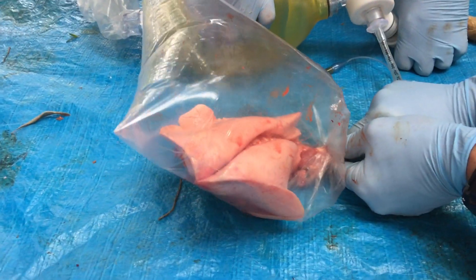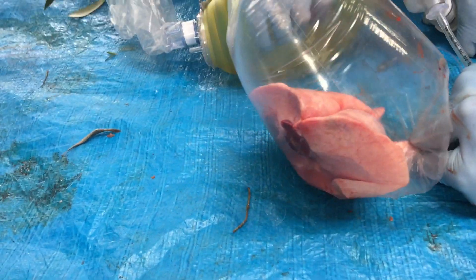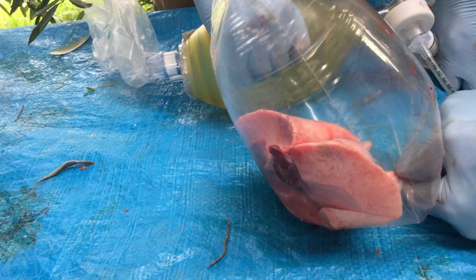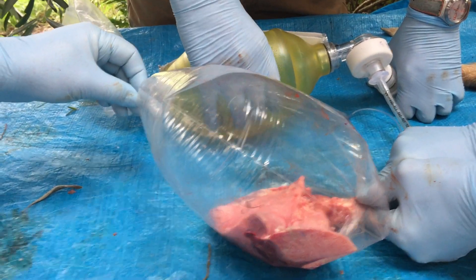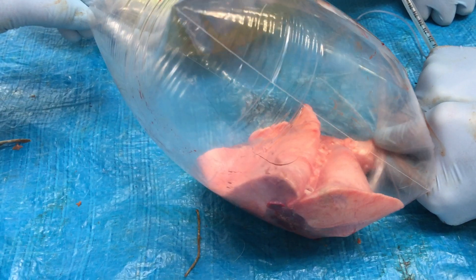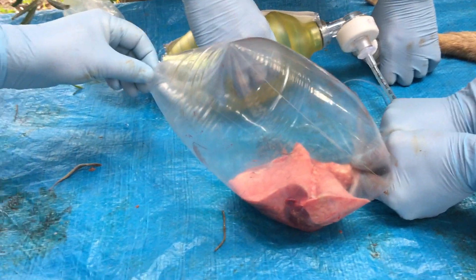It's starting to get harder to bag it now. It's getting really hard to bag it now, and those lungs just are not inflating at all. So it's really tensioned.